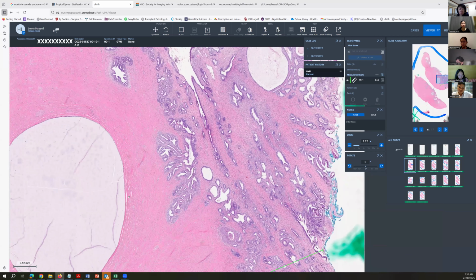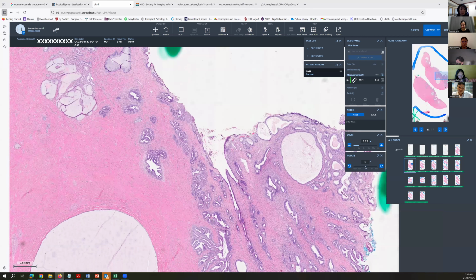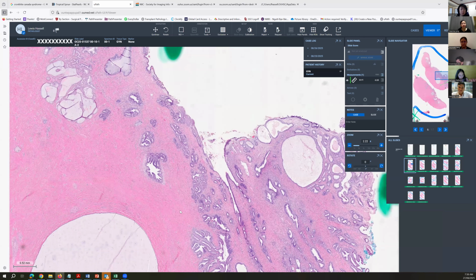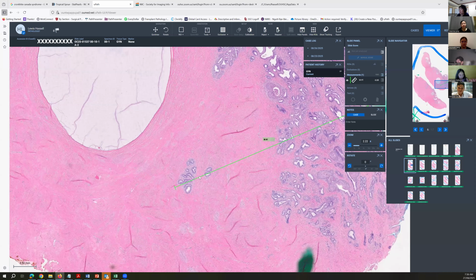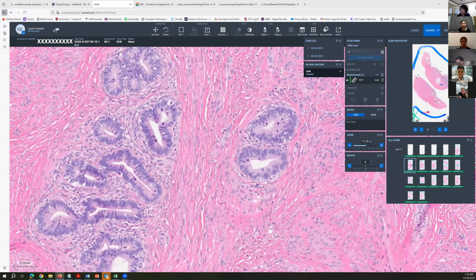And similarly over here, these are benign glands here, and the abnormal glands are at about the same level. Even here in this additional site where I measured a maximal dimension, this isn't deeper than this other gland here. And obviously these are somewhat hyperchromatic. Again, you've got the apical nuclei and so forth.